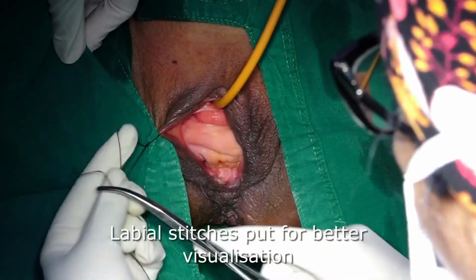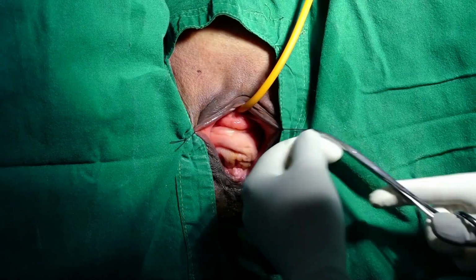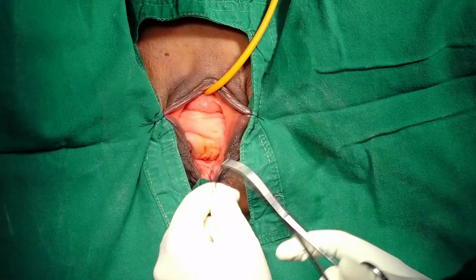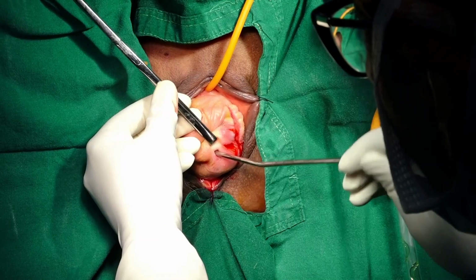This is the case of a 73-year-old lady with third-degree uterovaginal prolapse for whom colpocleisis was performed. We usually put labial stitches for better visualization. The apex of the prolapse, that is the cervix, is grasped with a vulsellum. And the uterine sound is used to confirm the position of the external os.